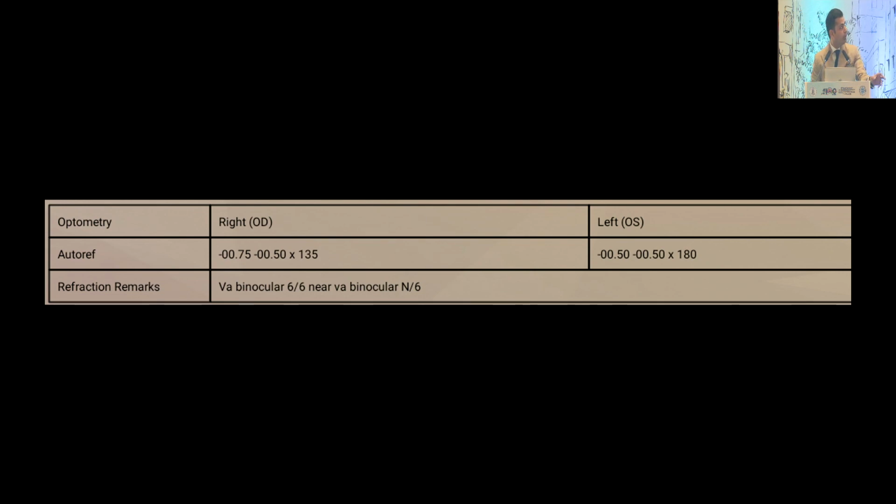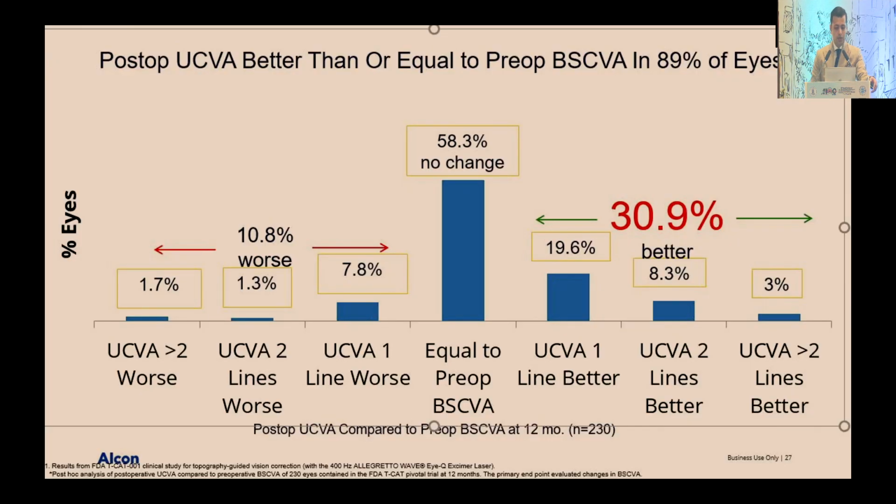But it goes to show you that these lasers can not only treat myopia and astigmatism excellently, but these topo-guided treatments can also treat hyperopias quite nicely. The only difference I do is in hyperopic LASIK, as I was told by one of the senior engineers, Ankur, is don't do it on the patient's visual axis, but try to do it on the center of the cornea, and I do value that point. So this is just to show you the data.